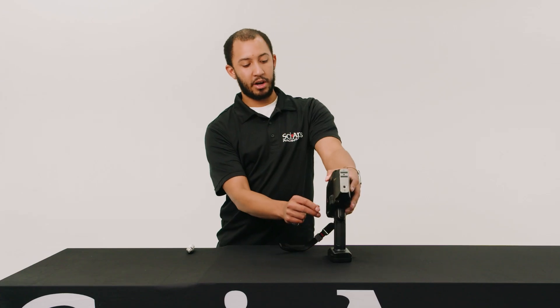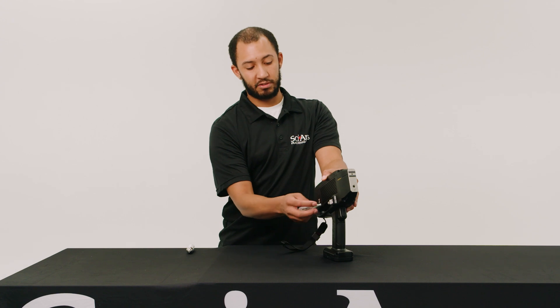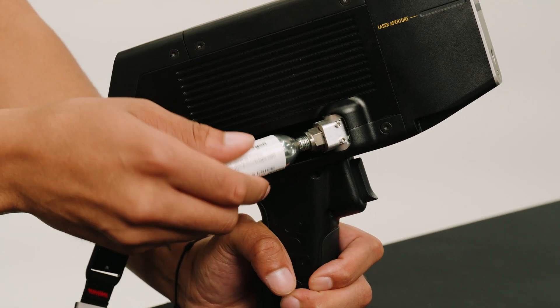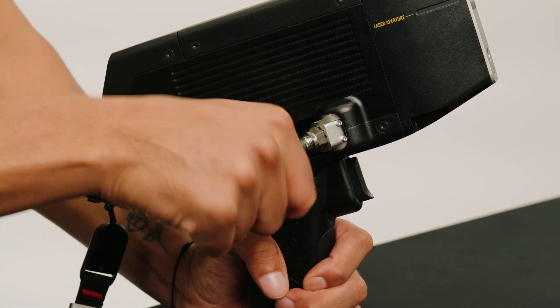Then you would go ahead and insert the argon canister on the side — on the right side of the unit. Be very gentle inserting it; you don't want to damage the o-ring that's in there.